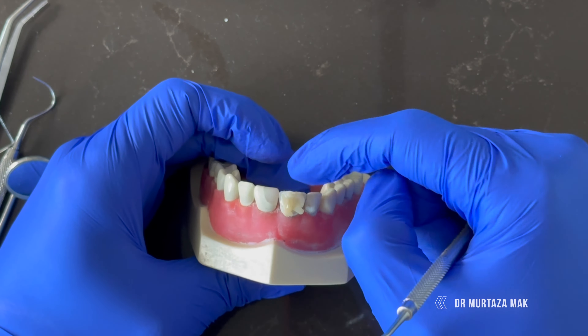You can take any composite, any color — if there's a particular shape, shade, or design that you had in mind from the initial consult with the patient, you can use that so the patient can assess it as well. We don't have to be 100% accurate; you're basically having a rough idea of what the final result can look like. You manipulate it with your fingers or a plastic instrument. You can use a bit of bond or a bit of Vaseline as a separating medium, and then prepare the tooth to where the shape looks okay. I'm just building up the central incisor, and then we go with the second central, then the lateral incisors.